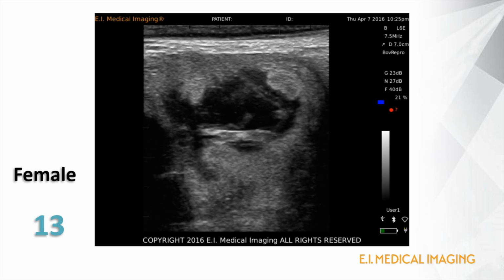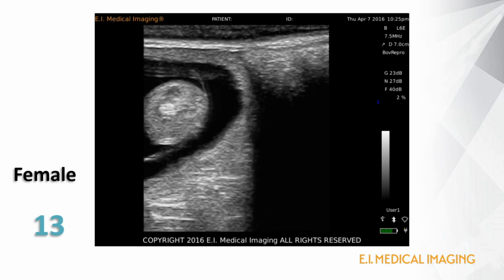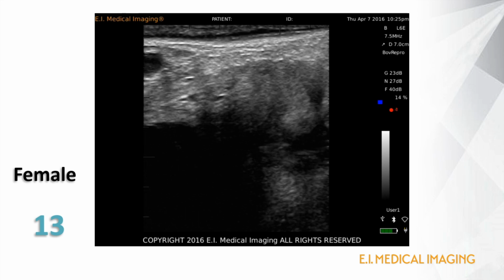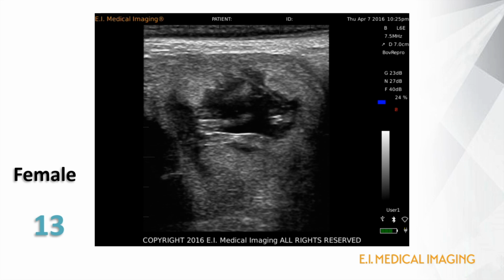The clip shows the hind end of the fetus in transverse section, with the hind legs pointing to the left. This is a little bit of a trick question because the image never explores the umbilical region. However, the female GT is bright and apparent under the tail if you know where to look. This is a heifer calf.